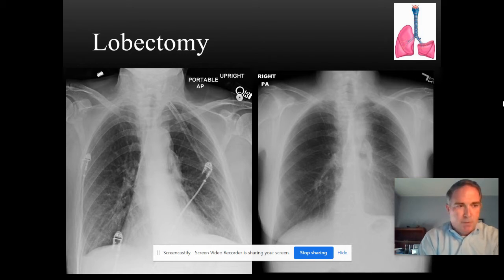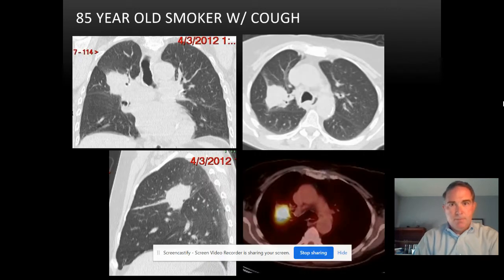So always good long term to, instead of calling that a small effusion, just check and see if they have a chest CT or an abdominal CT to see if there is an effusion there or if it's just a normal postoperative appearance. Then you're going to have midline shift to that side as well.